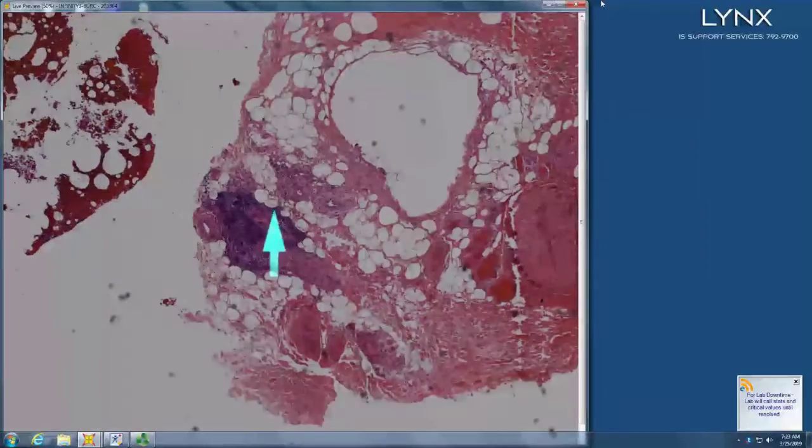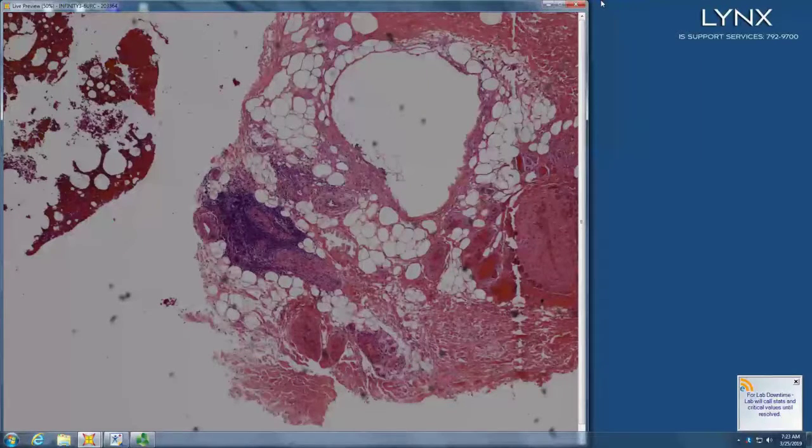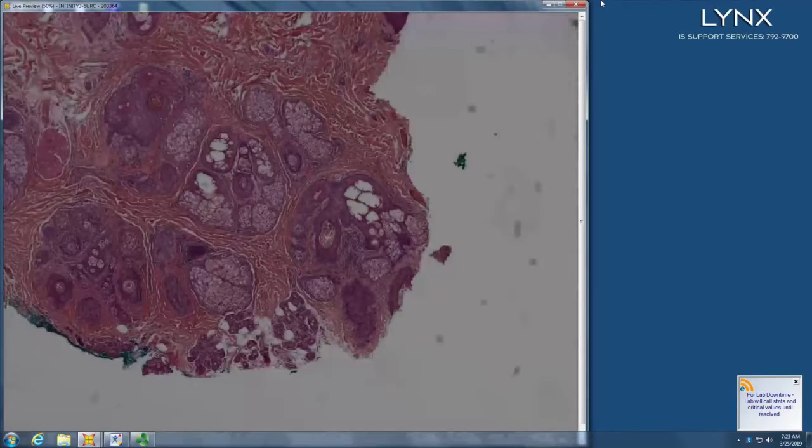Does lipodermatosclerosis usually give you nodular lymphoid aggregates? No. So what would give you nodular lymphoid aggregates plus lipomembranous change in the fat? Nodular infiltrate makes me think of lupus. Exactly, and lupus panniculitis can do lipomembranous change. So, excellent, you just saved that patient's kidneys. Well done. Good save.